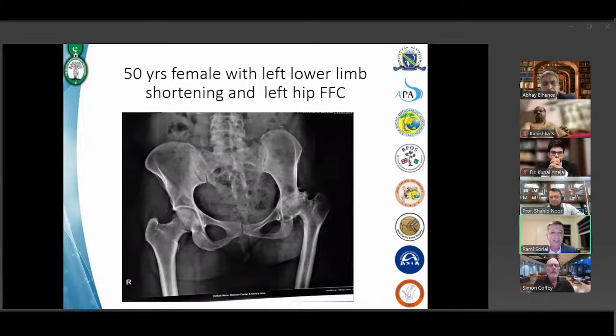It looks like something, you know, I'd be questioning whether she had some surgical procedure there in the past, but I can see no surgical procedure in the past. Right, I can see at least on the AP that I've got a reasonable intramedullary canal to work with here. It is smaller and hypoplastic compared to the contralateral side. There's certainly pelvic tilt. There's a hypoplastic ilium and hemipelvis on that side. There's an associated scoliosis. So we've got a leg length discrepancy that has to be measured. There's certainly a different offset to the contralateral side that's got to be taken into account.